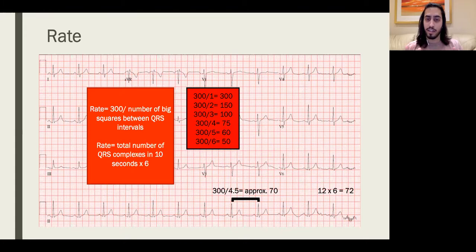And just a side note, you should always use ECGs in conjunction with clinical history. If someone hands you an ECG and just says, read it to me, you might be able to identify some alterations with the wiggles and the lines, but until you correlate it with the patient's bloods and the actual history, you don't know what's going on. But in terms of rate, this is how you calculate the rate. And I think most people are okay with this.